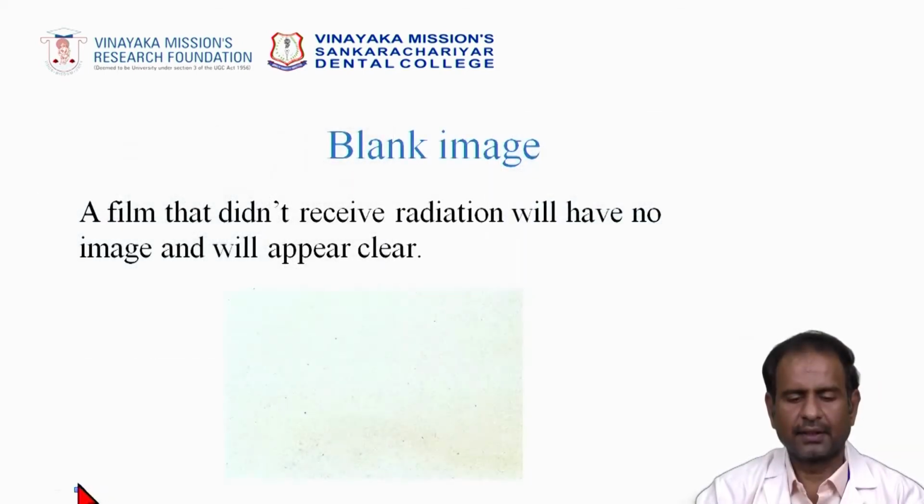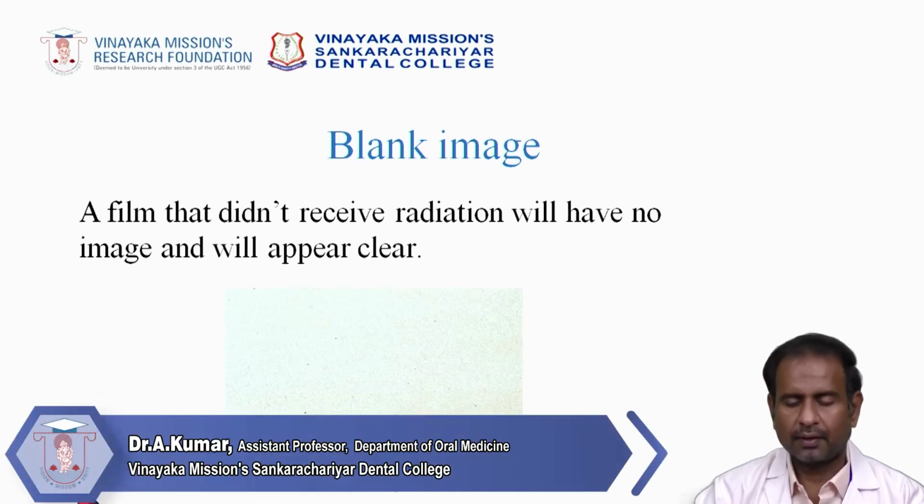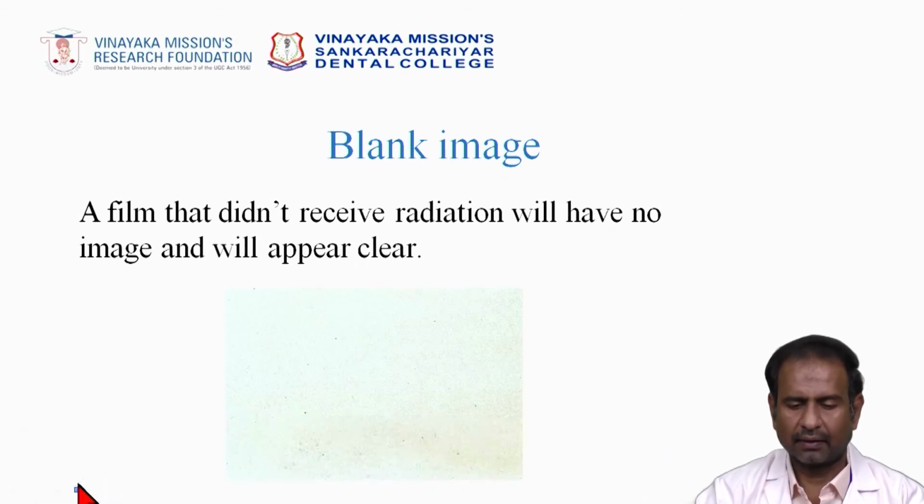Then blank image. A film that didn't receive any radiation, without being exposed, when you develop it, appears as this kind of image. This mistake will sometimes happen. That's how a blank image will occur.